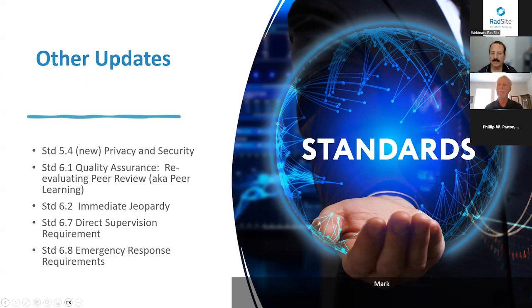Yeah, so go ahead, start, please, Phil. I think both of those parameters have some type of importance, but maybe more so on specialty exams than general exams. For example, you take CT, we can get a large detector array, but a 16 slice unit is oftentimes a workhorse of a hospital. They do a lot of the normal routine scans and they produce excellent images. So are we evaluating the images, or are we evaluating whether they are the most current CT unit? Because we could have gone to more slices, 64 or something along that line.